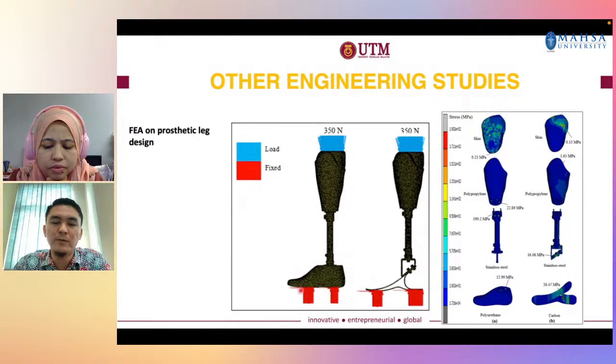Okay, the first one is really solid. Okay, and this one is only a structure, because some people may have different interests. So we simulate both conditions, and then we found that the solid one is more practical compared to the truss structure like this one, because the stress is higher here.